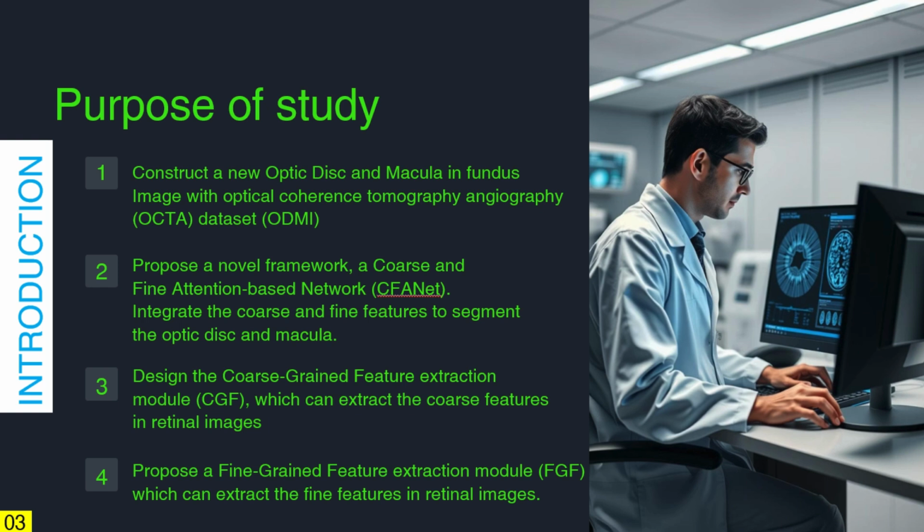Then we can use the coarse and fine features from the eye segmentation of the optical disc and macula to have further imaging of the OCT, and design a coarse grain feature extraction module to help extract coarse features from the original image, and finally propose the fine grain features to enhance and extract the fine features in the original image.